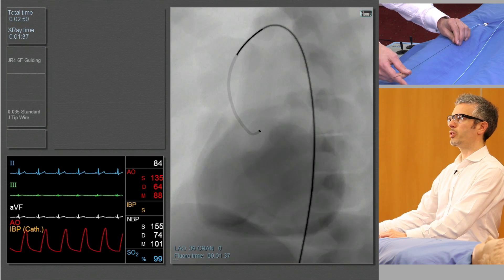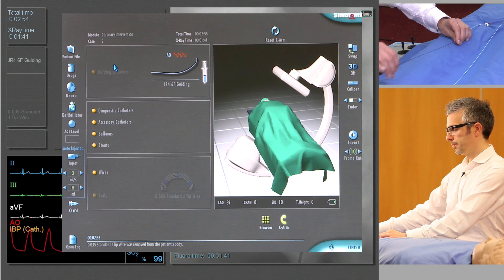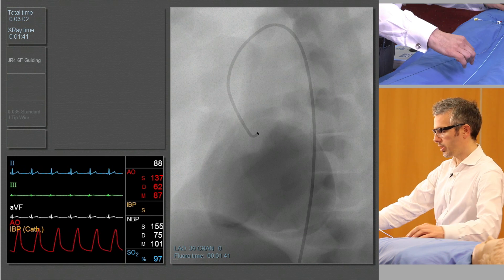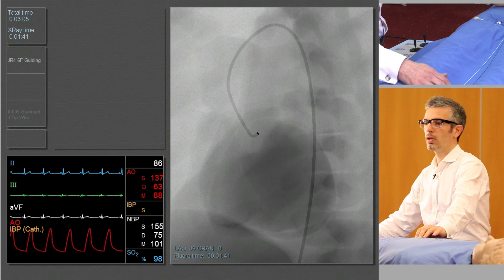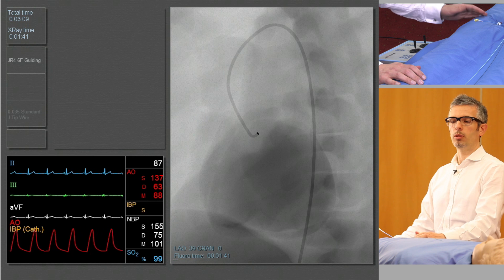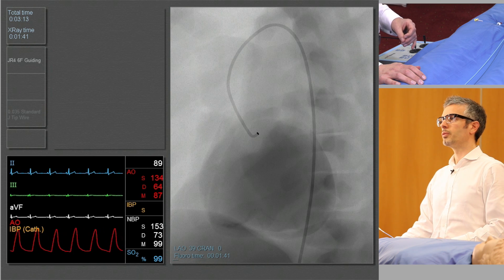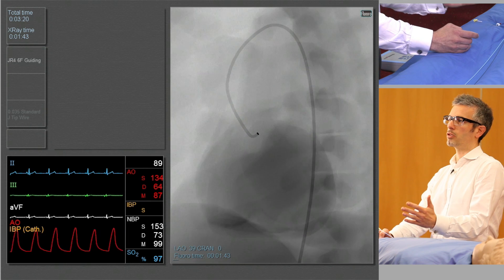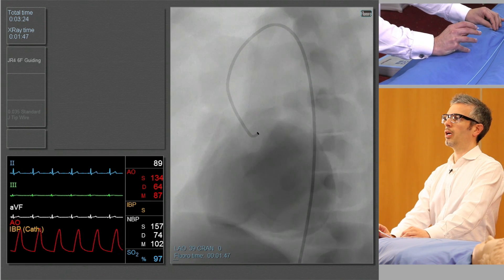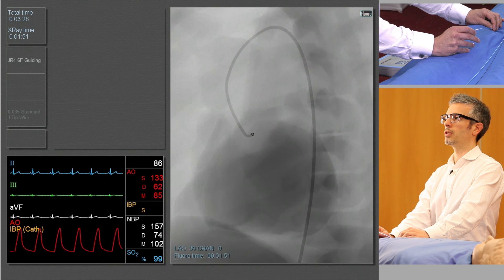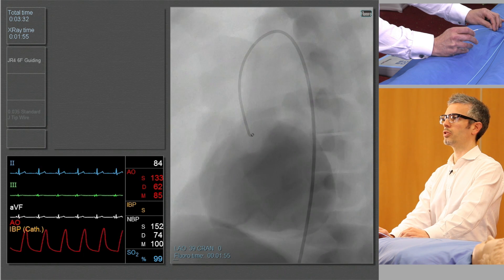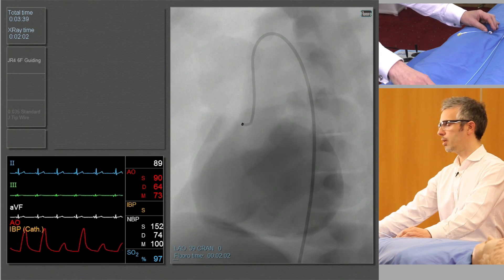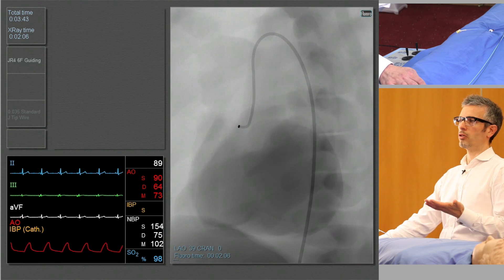For engaging the right coronary artery you commonly have to put a little bit more torque on the catheter. I'm extracting my wire here beforehand. This is where we would connect up the manifold, double checking that we've not got any air in the system. The right coronary artery comes off anteriorly, so moving into a left anterior oblique view allows us to outline the ostium of the right coronary artery — I'm expecting it to come off just to the left of the screen. I gently withdraw and rotate my catheter, looking for the characteristic jump as it moves into the right coronary artery ostium. That looked like it jumped across there, but before we do anything we check our pressure — and I can see the pressure is actually damped.